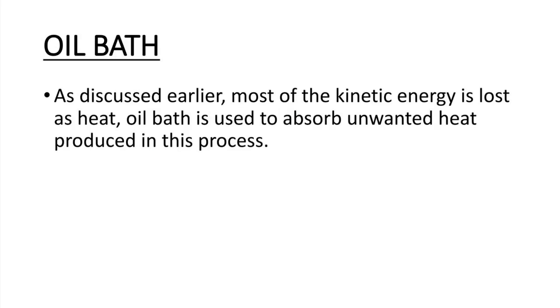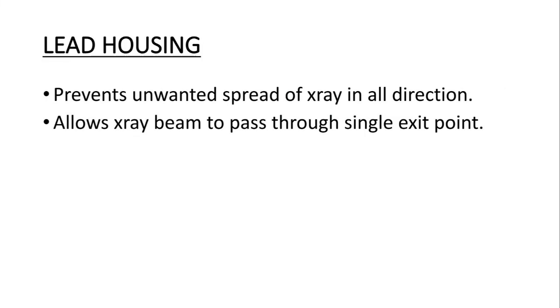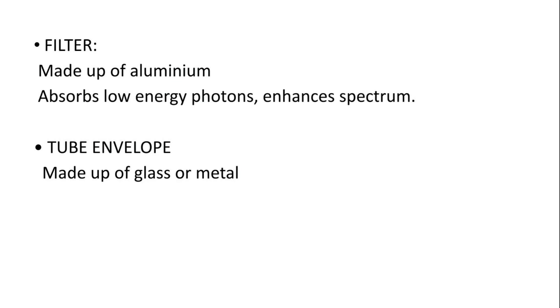Oil bath is used to absorb heat produced while creating X-ray. A lead chamber is created to prevent unwanted spread of X-ray in all direction. Few other parts are described below.